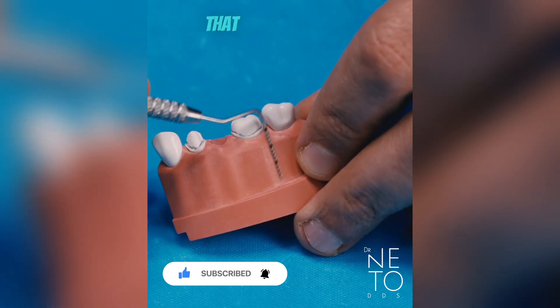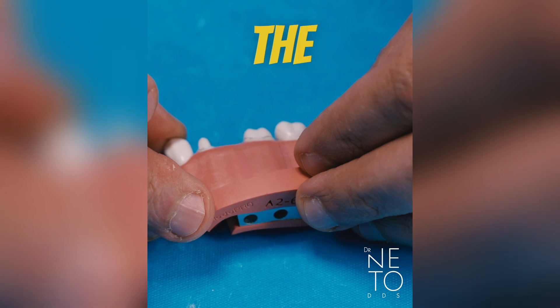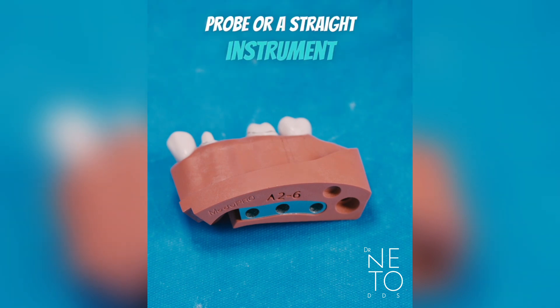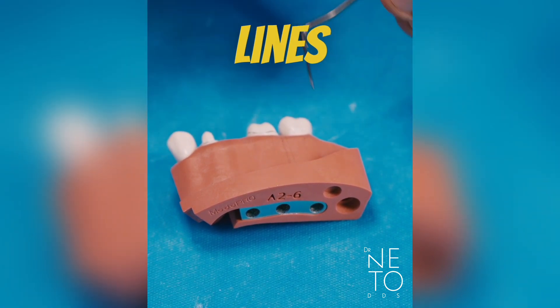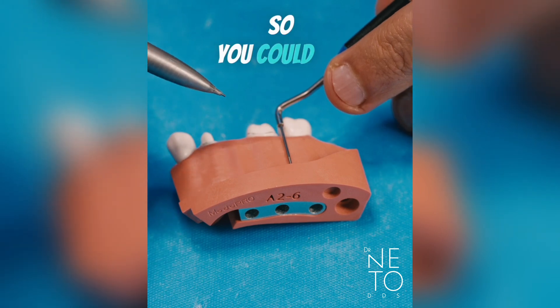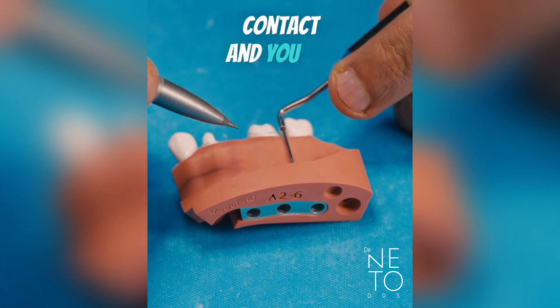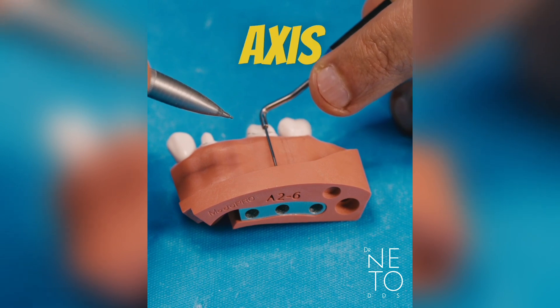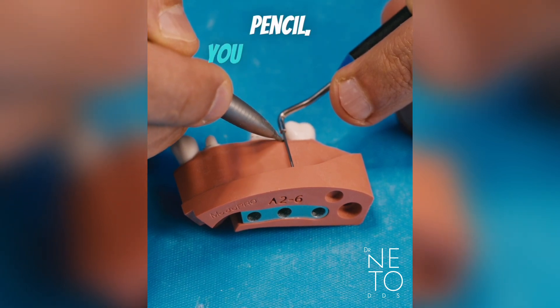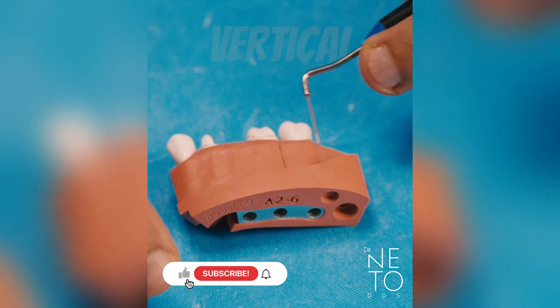You can see some of the lines I did previously here. To draw the lines, you can use a probe or a straight instrument to help you draw them like this. If you do it freehand, sometimes you get it wrong. So especially near the interproximal area where you need to break the contact, put your instrument there, imagine a long axis going this way, place your instrument, and go with your pencil — touch the instrument and draw a vertical line.